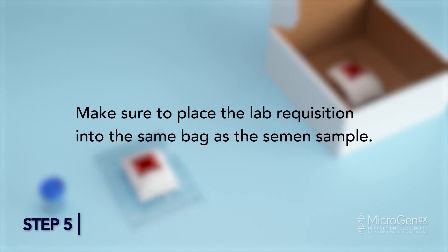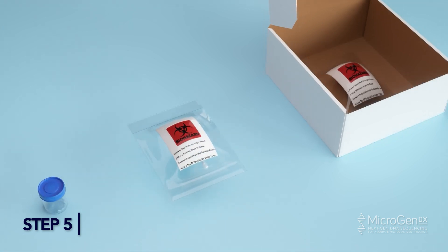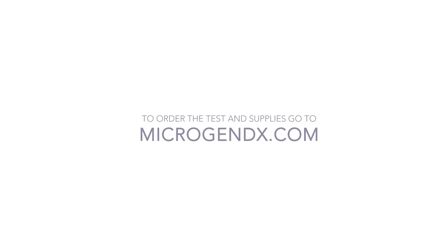Make sure to place the lab requisition into the same bag as the semen sample. Place the sealed bag into the MicroGenDX box. Once both samples are in the box, close the lid and ship out according to your facility protocol. Alternatively, take to the nearest FedEx Dropbox. To order the tests and supplies, go to MicroGenDX.com.